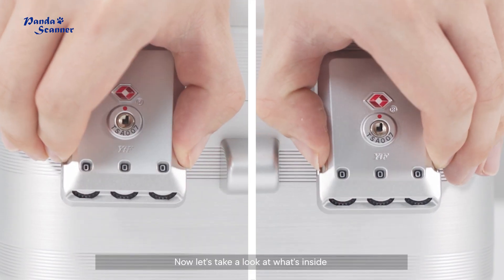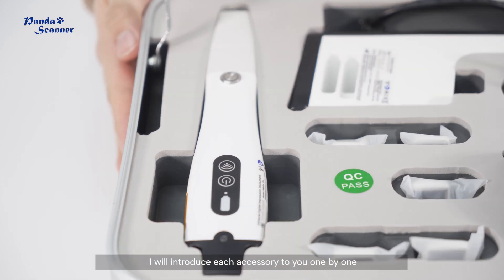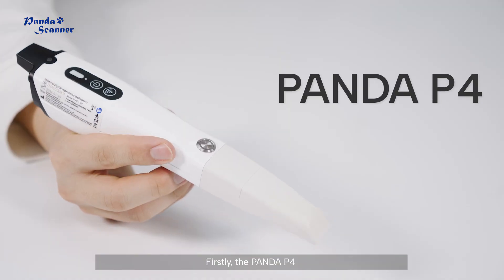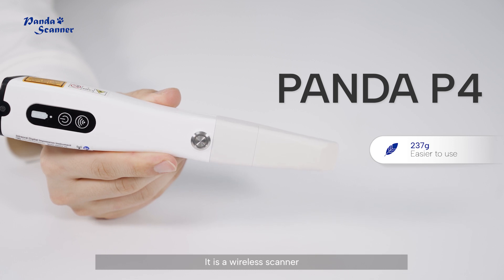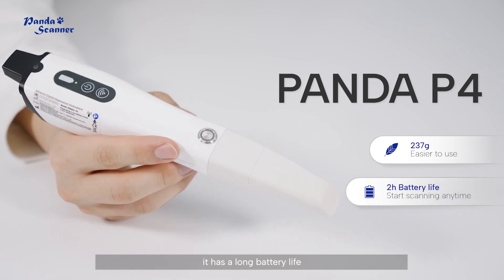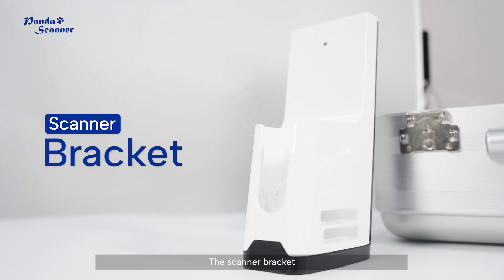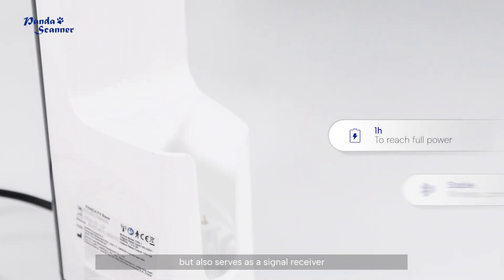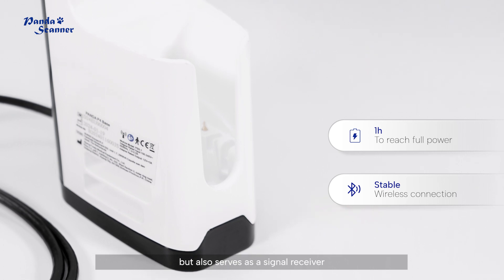Now let's take a look at what's inside. I will introduce each accessory to you one by one. Firstly, the Panda P4 — it is a wireless scanner, lightweight with a long battery life. The scanner bracket is not only the charger but also serves as a signal receiver.